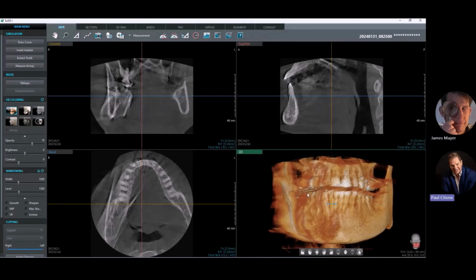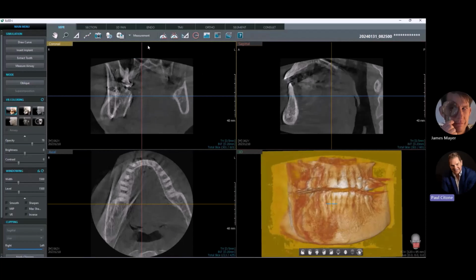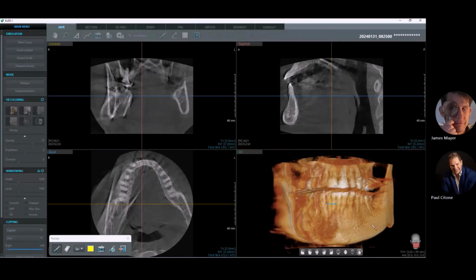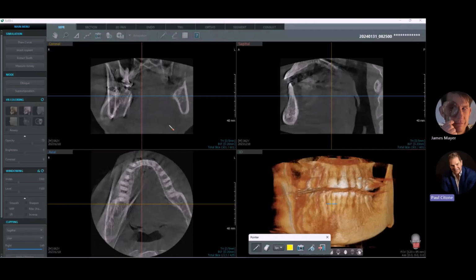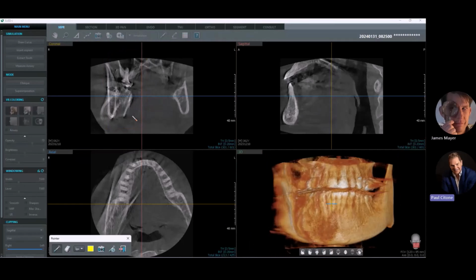In this case, the patient moved as the scan was being taken, because one side is fairly clear, causing that entire right side to be completely distorted. You can see it especially in the coronal view, where they probably moved their whole head, moving that jaw left and right, creating a ghosted image. You see the jaw about 3 times, creating that overlapping ghosting.